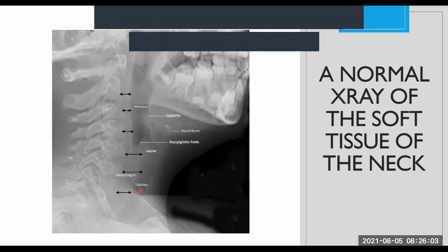So how does an X-ray work? An X-ray is a fancy way of saying a photon, all right? So what they call X-rays were actually photons. So you're shooting off a photon. So a photon can just pass through your body. That's the whole point of it, all right? So when it passes through your body, if it hits something solid like a bone, it gets stopped, all right? So the film that's at the back doesn't get the photon, so it creates an image like that. If it hits something semi-solid, like a liquid or something like that, then you may get a slightly lighter shade, but it still can't pass through. And when it hits air, it can go through completely. So when it hits the film, it turns the film dark. All right. So that's how X-rays function.